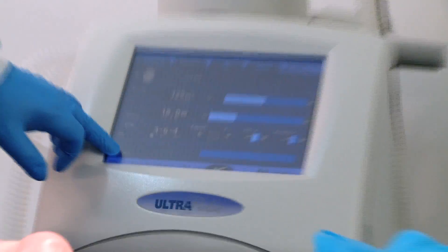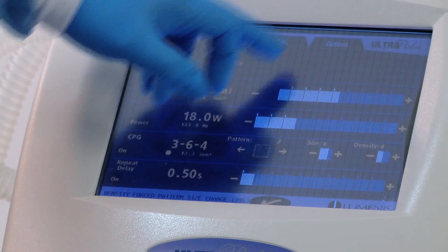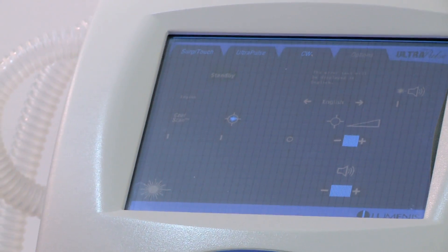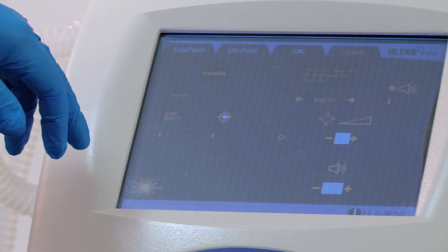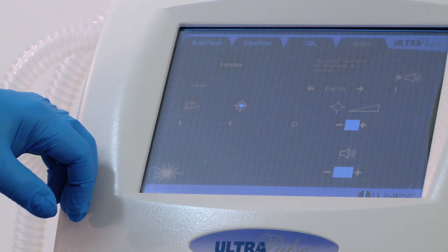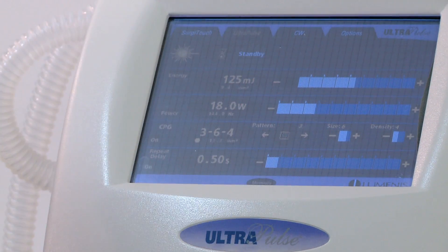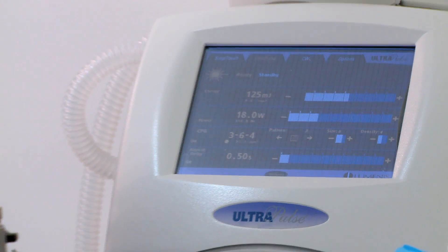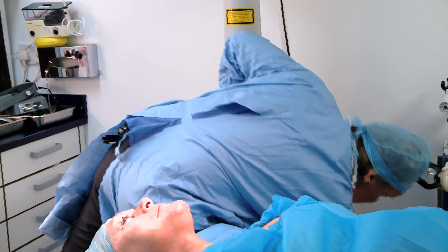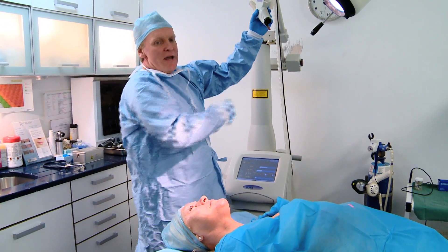In terms of the repeat delay, I tend to prefer 0.5. If we go to options, we can turn on the cold scan — this is the computer pattern generator — and you can hear the machine takes on a different sound at that stage. The machine is now on standby and will kick on when ready. The plume from the vaporization will run through this machine right through the head itself.